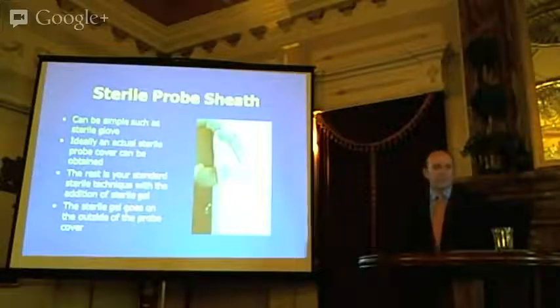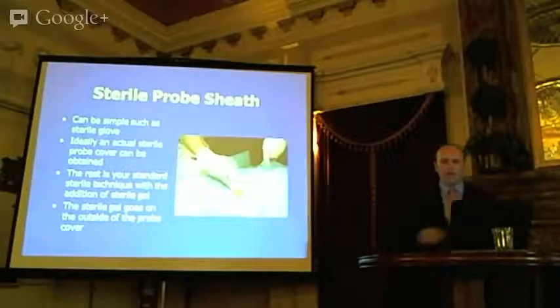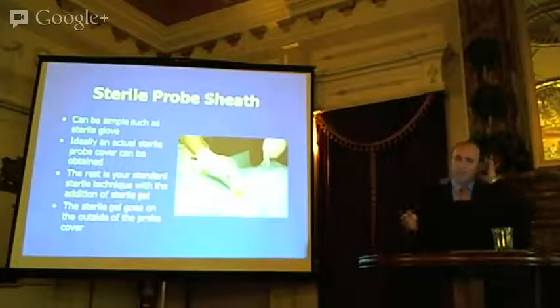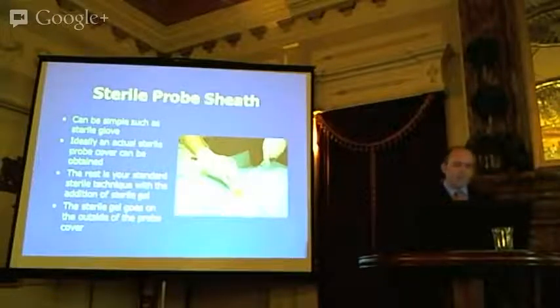The jury's out. This is how we used to do sterile ultrasound guided vascular access procedures many years ago. So whether you use a glove, which is tough to find now in North America, or much more extensive draping, you want to make sure to adhere to all sterile practices for your hospital. And obviously, if you've seen the progression, pretty soon we're going to be covering an entire room with a drape. I'm not sure what we'll be wearing exactly. It'll take an hour to set up.